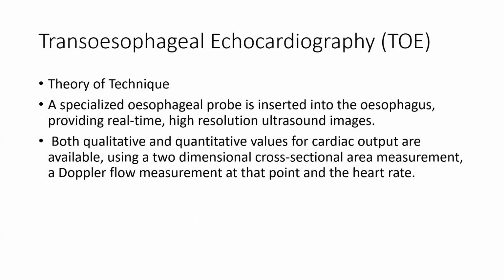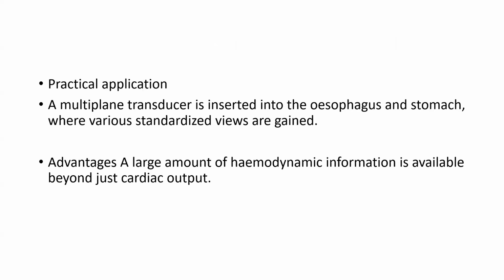Now, transesophageal echocardiography. The specialized esophageal probe is inserted into the esophagus, providing real-time, high-resolution ultrasound images. Both qualitative and quantitative values of cardiac output are available, using two-dimensional cross-sectional area measurement, the Doppler flow measurement at that point, and the heart rate.